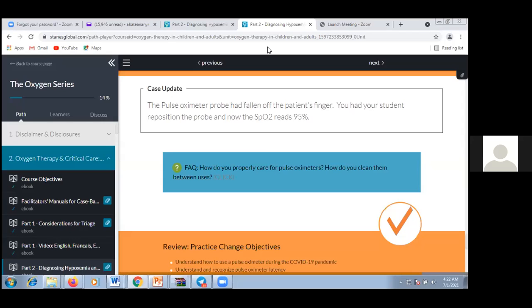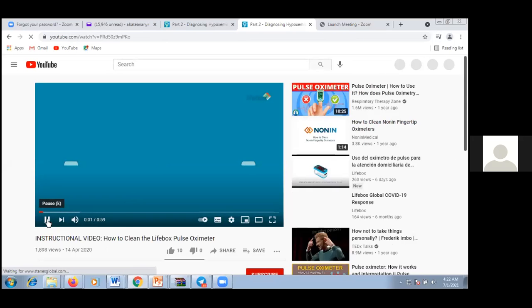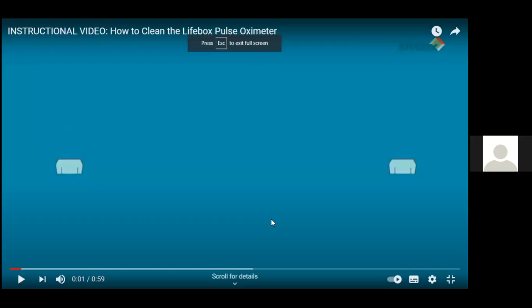Last week, we lost one pulse oximeter. Unfortunately, it was near the heater, so excessive heat is one of the factors that damages pulse oximeters. The other thing we should take care of is during insertion and removal from the monitor: we have to be very gentle and avoid kinking of the cables.